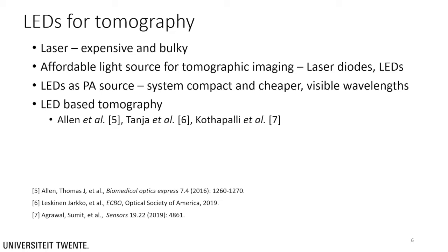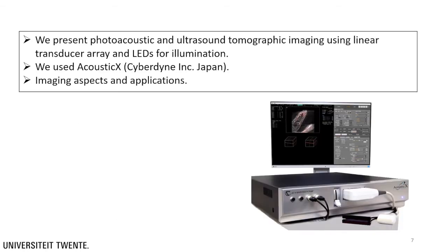Allen and Beard have demonstrated using LEDs for tomographic imaging using a single element transducer. Recently, other groups also showed the feasibility of using LEDs for photoacoustics. Here we present photoacoustic and ultrasound tomographic imaging using a linear array and LEDs for illumination. The system that we used is the AcousticX by Cyberdyne, and we will go into various imaging aspects and show some applications.